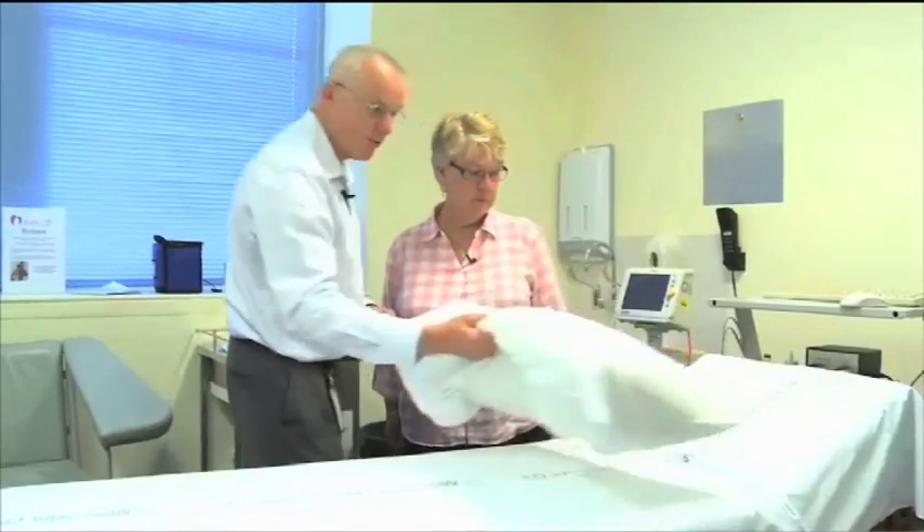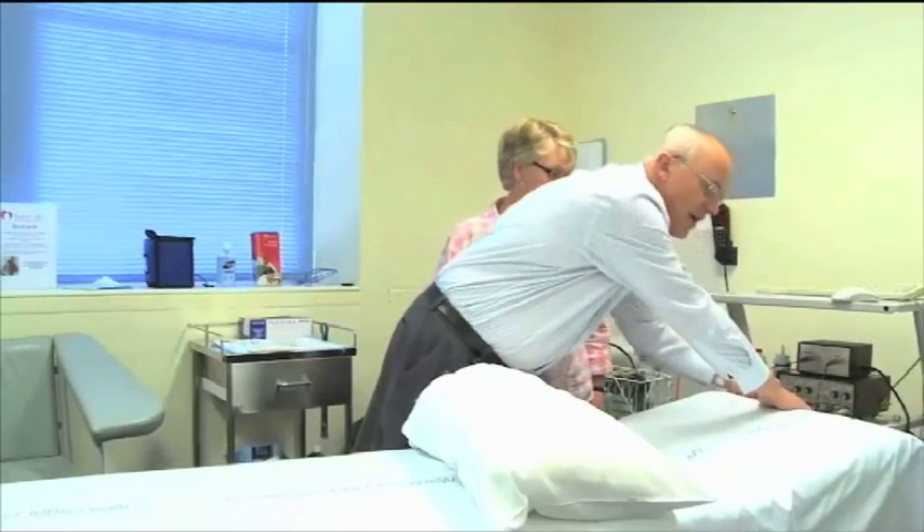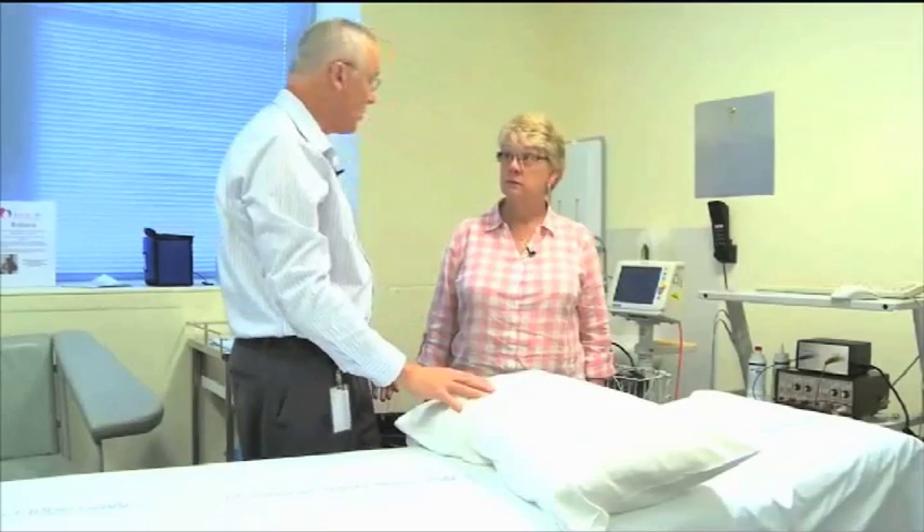Okay, Lynn, so we're going to put just 0.3 in your band today and hopefully that'll get you just into that right zone again. Before we get you up on the bench, I want to do a couple of things. Remember we put you back over the pillow and we'll flatten this down. It'll make it much easier for us to feel where the port goes.